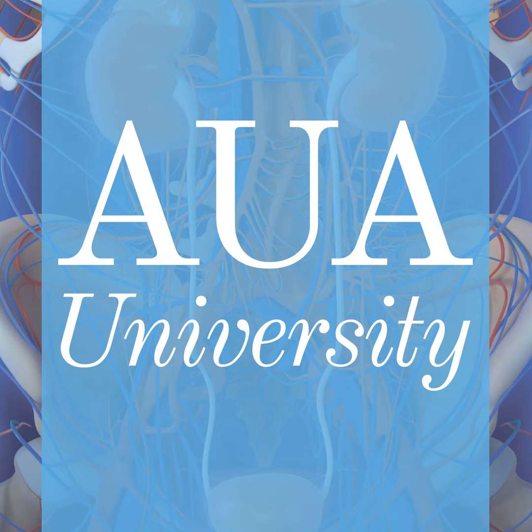So the conclusion, and this is one of the only studies which has concentrated on PSMA PET scan in radiorecurrent disease: we have a high accuracy of both methods to identify local recurrent disease. So we might even discuss sparing a biopsy in those patients prior to any type of local treatment, because we never had a false positive PSMA PET scan in this situation. There is a high accuracy of positive lymph nodes if the PSMA PET scan is positive, as you already have heard from Dr. K. And there is a low accuracy to predict negative lymph nodes.